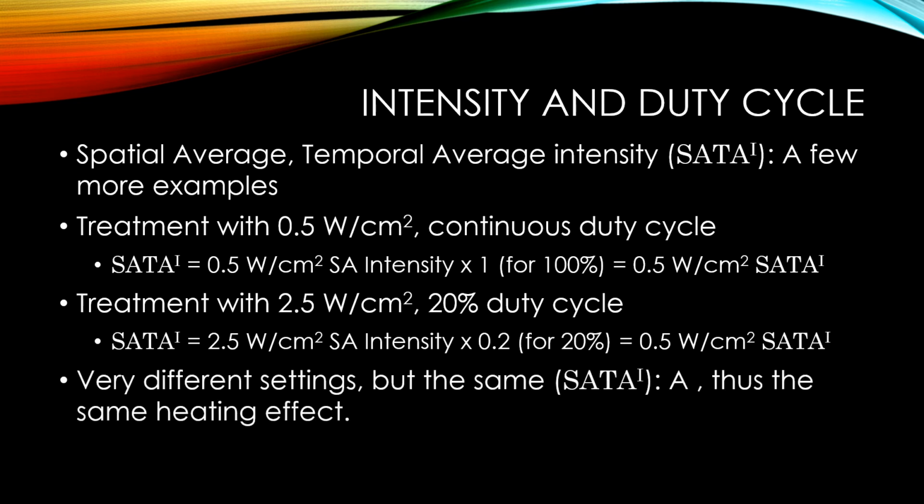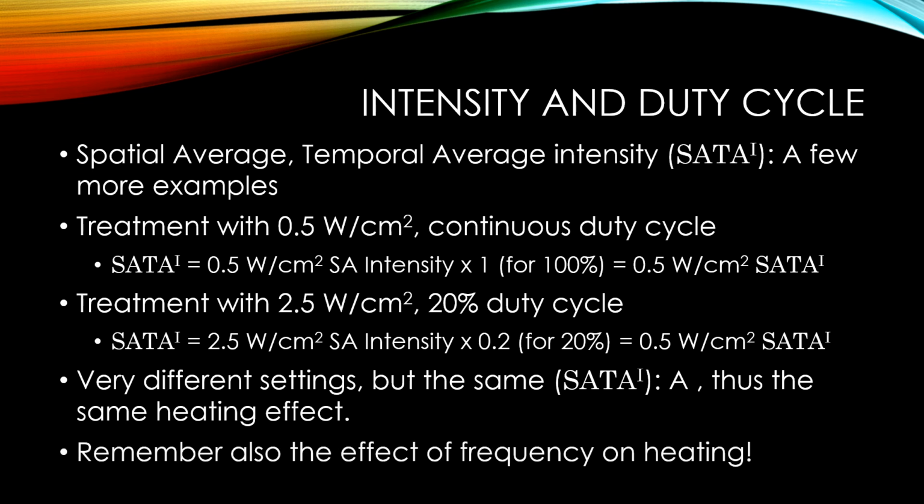So notice in those two scenarios, we have very different settings, but we have the same spatial average temporal average intensity. Thus, we have the exact same heating effect between those two treatments, even though there's a big difference in spatial average intensity and a big difference in duty cycle between the two. The other thing we need to remember, of course, is that effect of frequency on heating, where 3 megahertz will heat 3 to 4 times faster than 1 megahertz ultrasound.